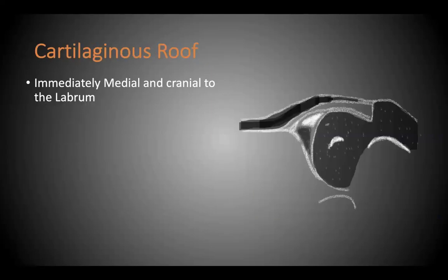And the last thing is the ilium, which is your bone, and then the lower limb of the ilium. So you should be able to trace the ilium starting from the top and then going down all the way up to the lower end of the ilium.